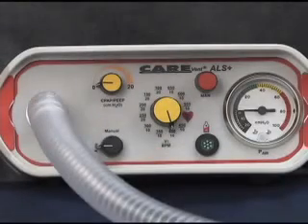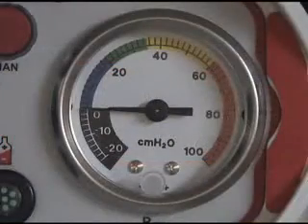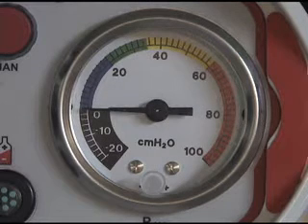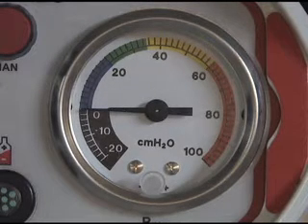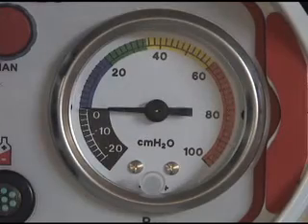Overinflation is prevented and airway blockage indicated by the audible pressure relief system. Should the airway pressure exceed 60 centimeters of water, excess gas volume is vented to atmosphere, and an audible warning tone is heard during the inspiratory phase of the ventilations.